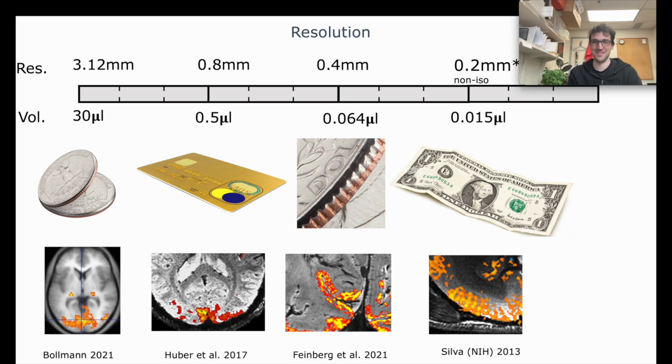with a correspondingly optimized experimental or sequence setup. And also usually when I try to see if my resolution is doable, I'm not only seeing what other people are doing or looking at the square root of the voxel volume only, but basically also trying to orient myself on what people can do in structural imaging. Usually the limit in structural imaging is further than with functional imaging, but not so much. It's usually 1-2 orders of magnitude in there.